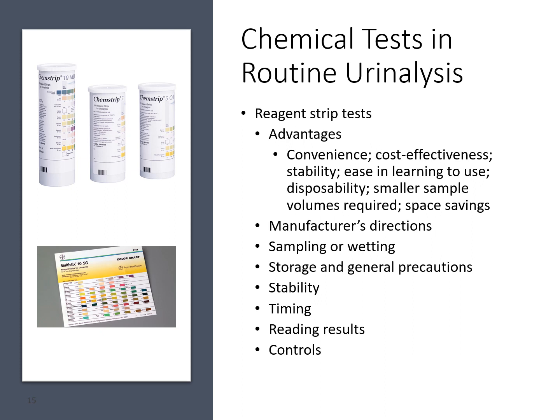Depending on the manufacturer, it may expire after it's been open for so long, like after you've actually opened the container and started using it. And you need to also make sure that you're using the strips within their expiration date, not only the open expiration date, but also the manufacturer expiration date that's printed on the label. You need to make sure that you properly time your reagent strips.